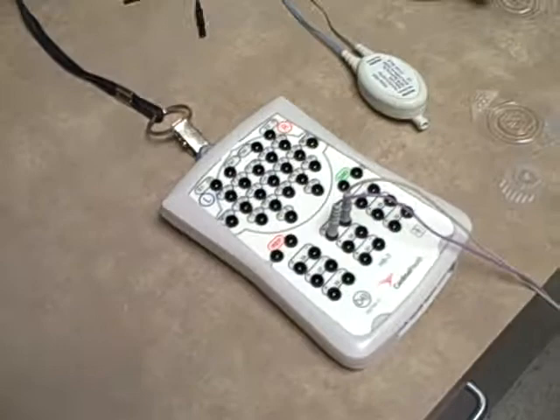Once we have that, our next step is the head box. With our head box, we need to connect all the wires that we just previously placed on the patient. We'll film the head box here and you'll see me plugging in the wires.